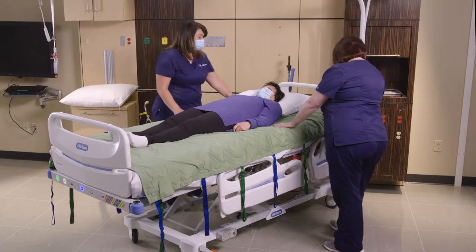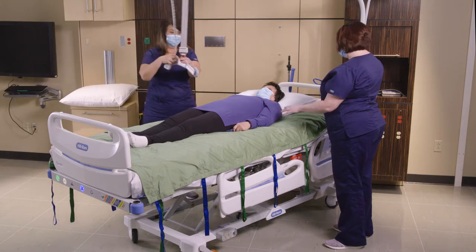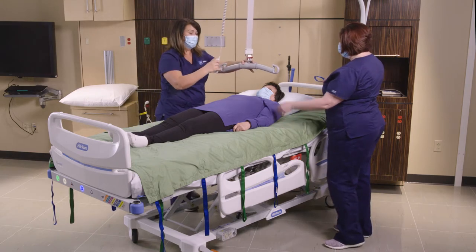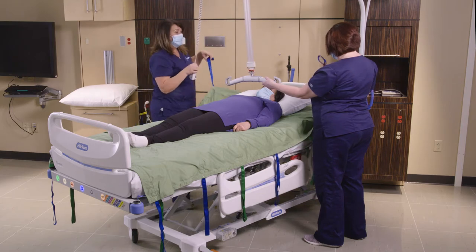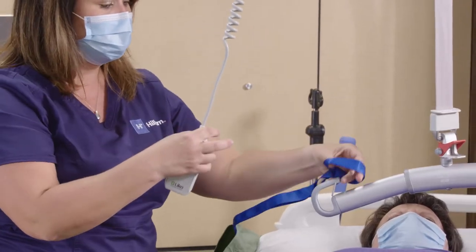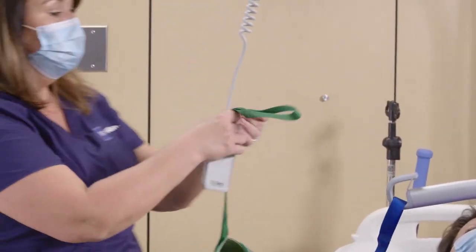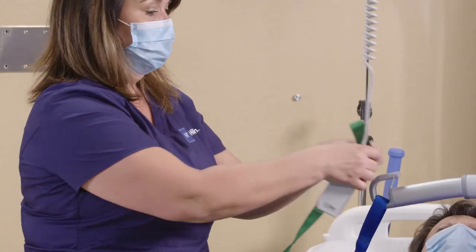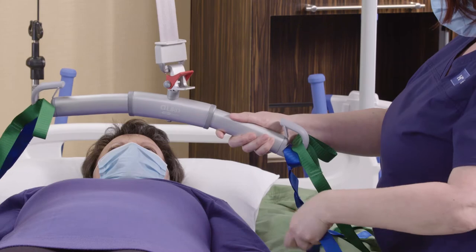When we get ready to boost our patient, we want to get the lift. Lower it down to about chest height, and then we're going to take our loop straps on the outer loop for the first connection. Then we go to the middle loop on the second strap, and connect the third strap again on the middle loop.